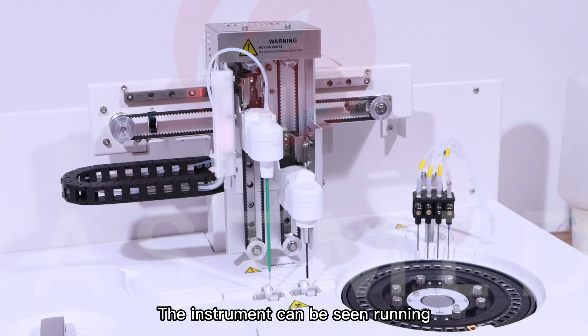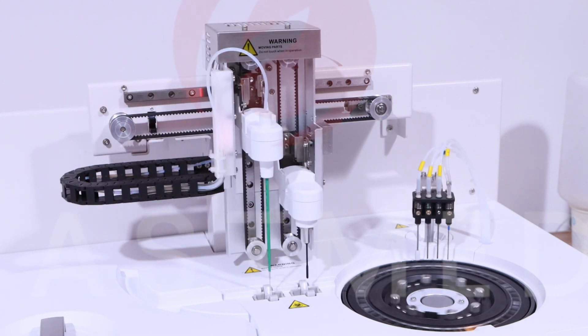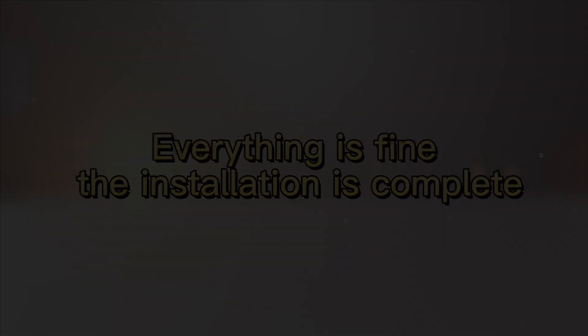The instrument can be seen running. Everything is fine — the installation is complete.